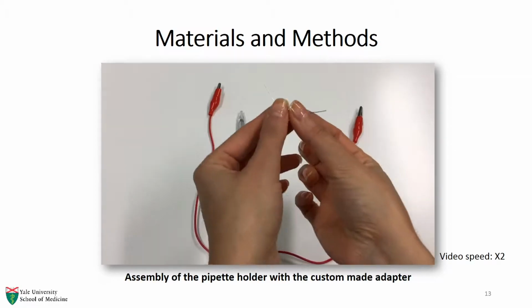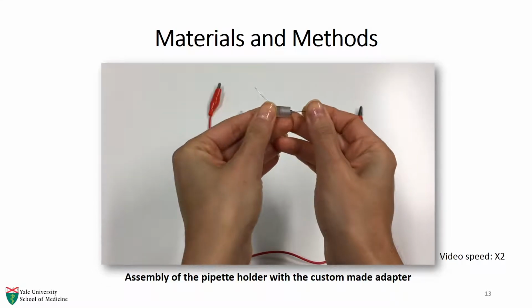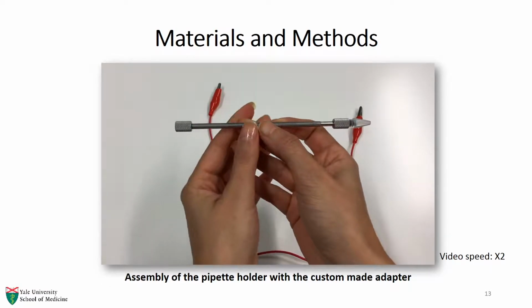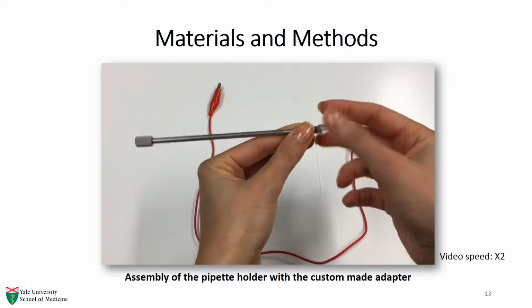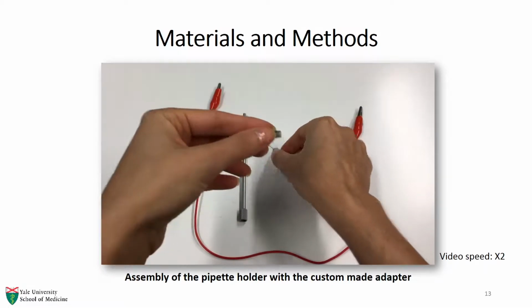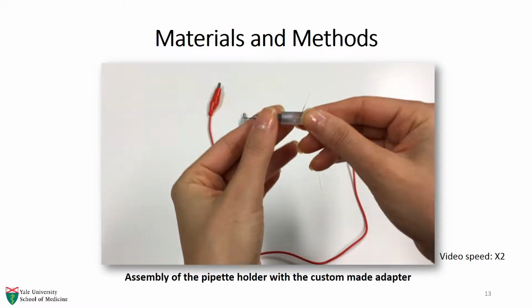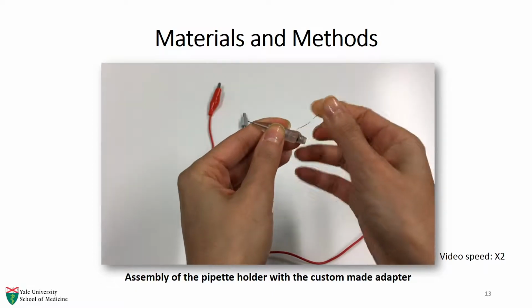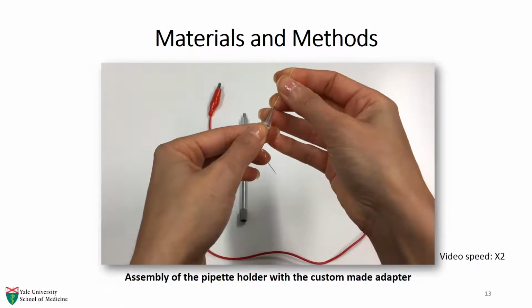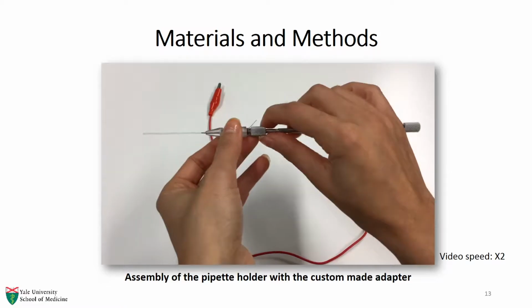In order to measure electrical resistance in an ICSI system, we had to manufacture a specific adapter. This adapter integrates into the micropipette holders, the holding pipette and the ICSI pipette. The whole purpose of this adapter is to introduce an electrical wire into the micropipettes. In this video, you see the assembly of this adapter and its integration into the ICSI system.